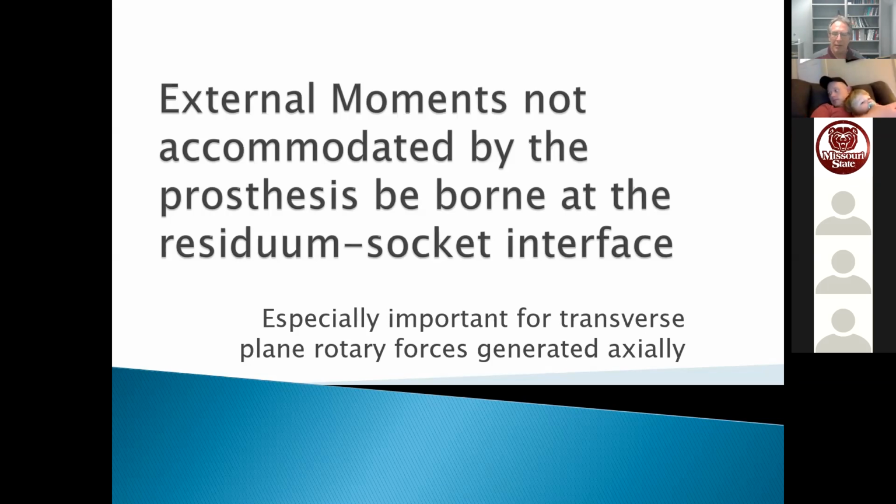So frequently, they have non-healing wounds. And what you really don't need with a proclivity for non-healing wounds is friction, because that friction can cause scratches and abrasions on a residual limb. So we need something to absorb those rotational forces so they are not between the prosthesis itself and the residual limb, because those forces, those torques actually, are going to be happening someplace.